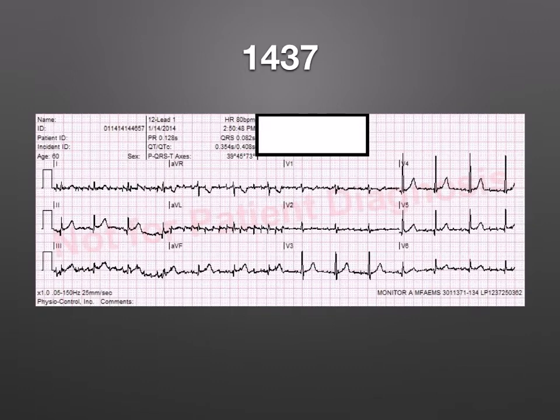I would love to be able to give you only ECGs that have no artifact. I would also love to be able to flip the magic flux capacitor switch on the ECG machines that eliminates all artifact. Unfortunately, I haven't been able to figure out where that flux capacitor switch is. Maybe we'll find it in the future somewhere. But what we see here is pretty much a non-diagnostic EKG. If you're looking down in the inferior leads with a microscope, maybe you can convince yourself that there's something there, but this is not diagnostic.